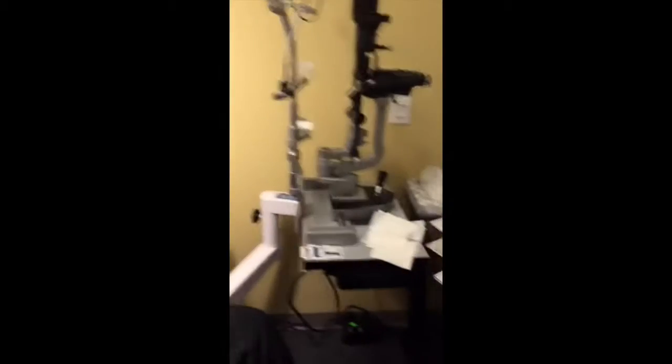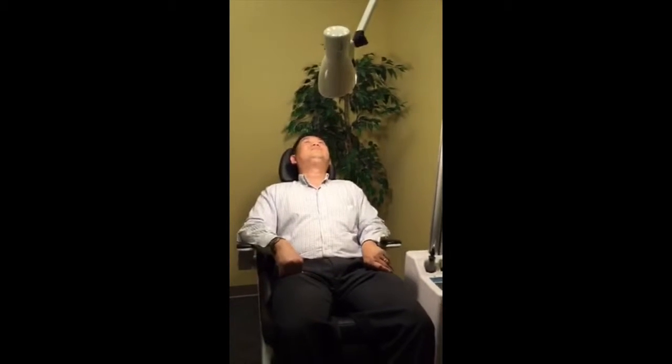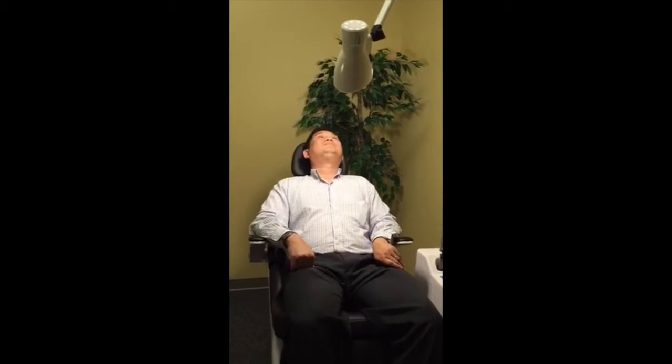So what Kybella is, and what he has on his chin, these little funny dots, is a way for melting fat with injections underneath the skin, and our patient here is willing to allow us to show this so that people can learn about this. So I don't see anyone chiming in just yet, but we'll see if people tune in. We'll see little comments there, and I will get going. Do you have a pair of gloves for me, please? Very good.